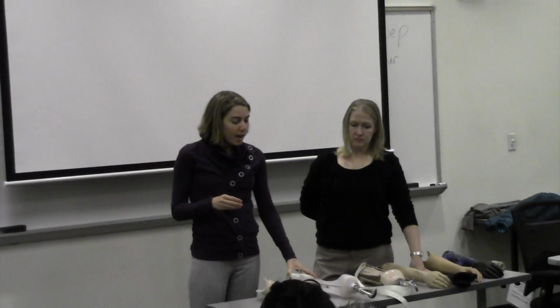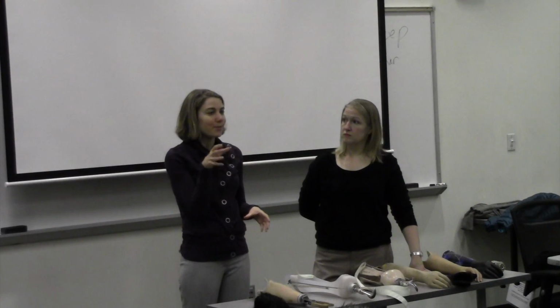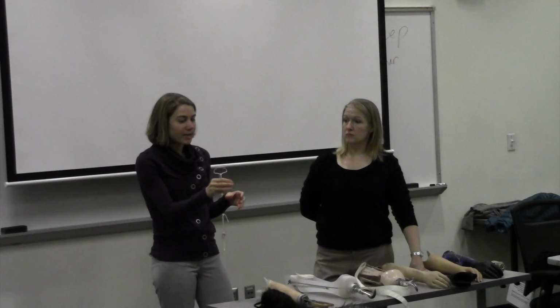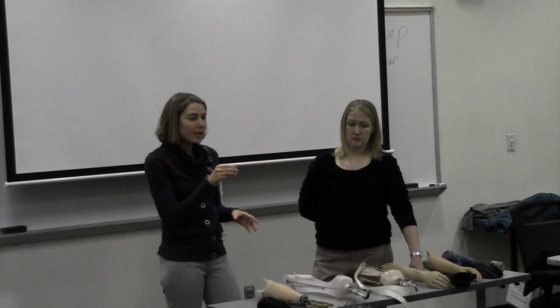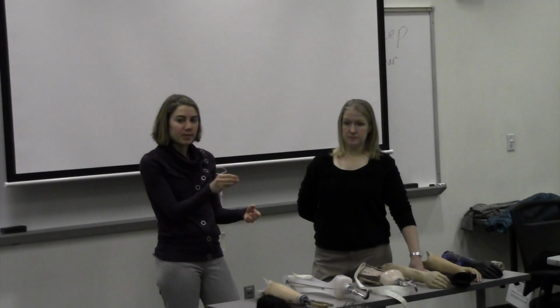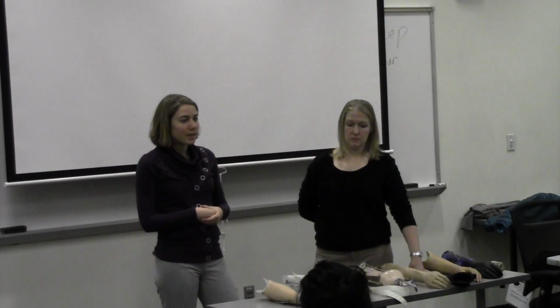One of the disadvantages and advantages of voluntary opening versus voluntary closing is that with voluntary closing, you can apply however much pressure you want. Say you're picking up a Coke can, you can squeeze it very lightly and not crush the whole can. But it takes muscle strength the whole time because you're having to hold the whole time, versus the voluntary opening, where you use your muscles to open it, and when you release, it closes, so you don't have to use any strength once it's closed. So if you're holding something for a long period of time, you want the voluntary opening.